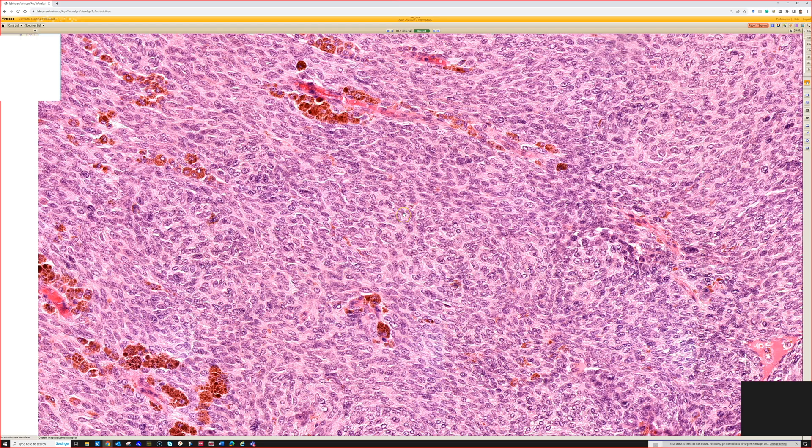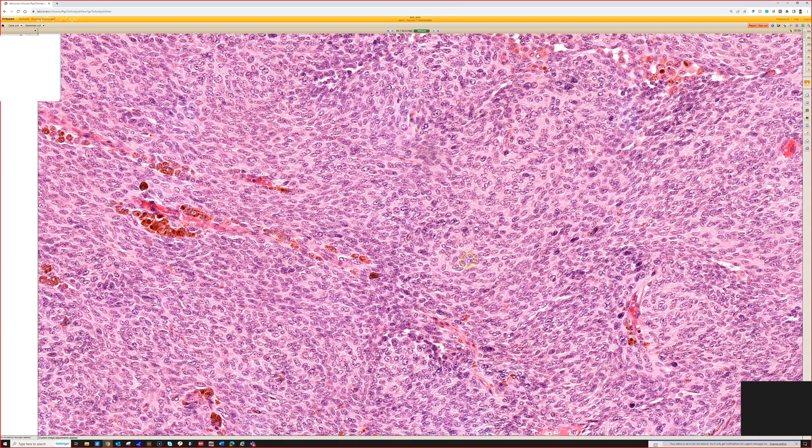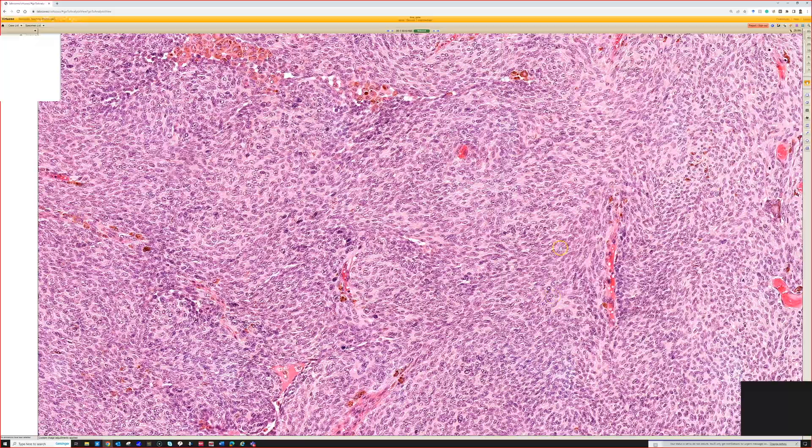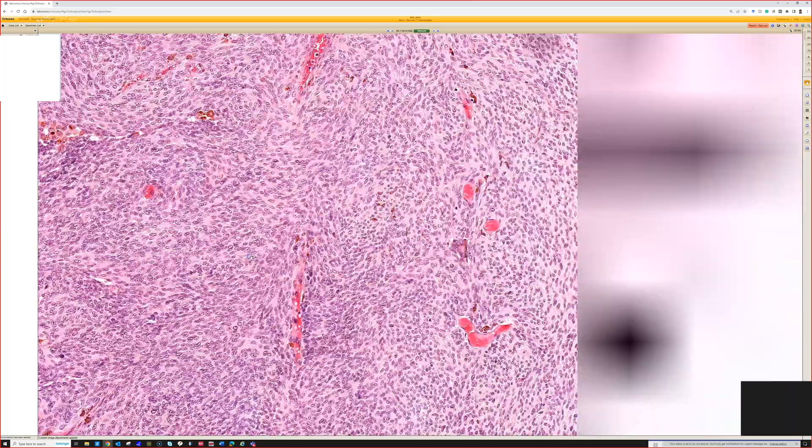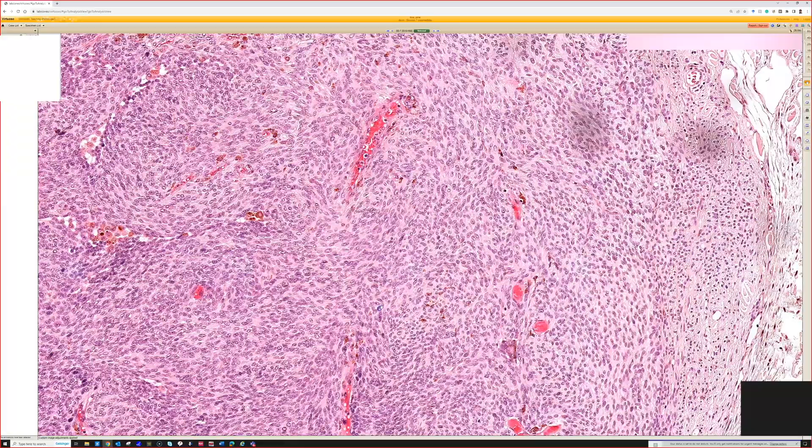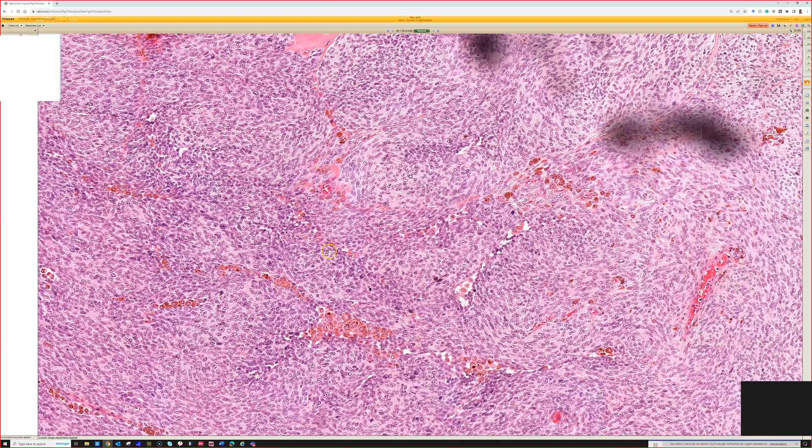If you start seeing really big nucleoli, you would want to think of a blue nevus-like melanoma or a clear cell sarcoma, which used to be called melanoma of soft parts because it can stain like melanoma but has a translocation involving the Ewing's gene. If you see a lot of atypia or big nucleoli, then you would get worried about melanoma or maybe a clear cell sarcoma.